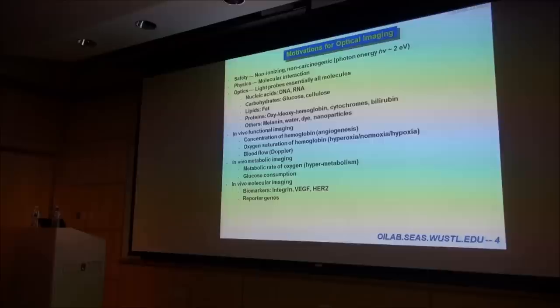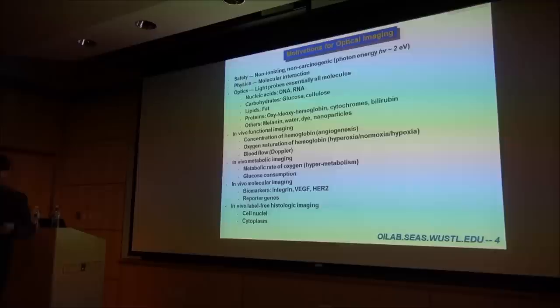Recently, we're pushing in vivo label-free histologic imaging. As we know, conventional histology requires excision of tissue and labeling of the tissue slides. Here, we're going to bring that in vivo. We can image cell nuclei and cytoplasm to match the standard H&E staining in histology. The list actually goes on and on.